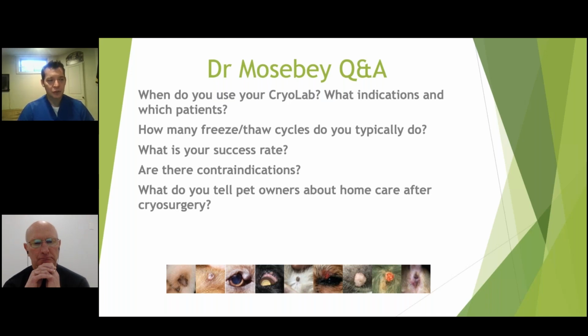So it's usually tell them to leave it alone. If it's bothering them, let us know. Hey, if we need to use an NSAID, or we just need to use a wrap or an e-collar, worst case scenario, to keep them away from it, we can do that. It's been really minimal, the number of patients where I had any issues afterwards.